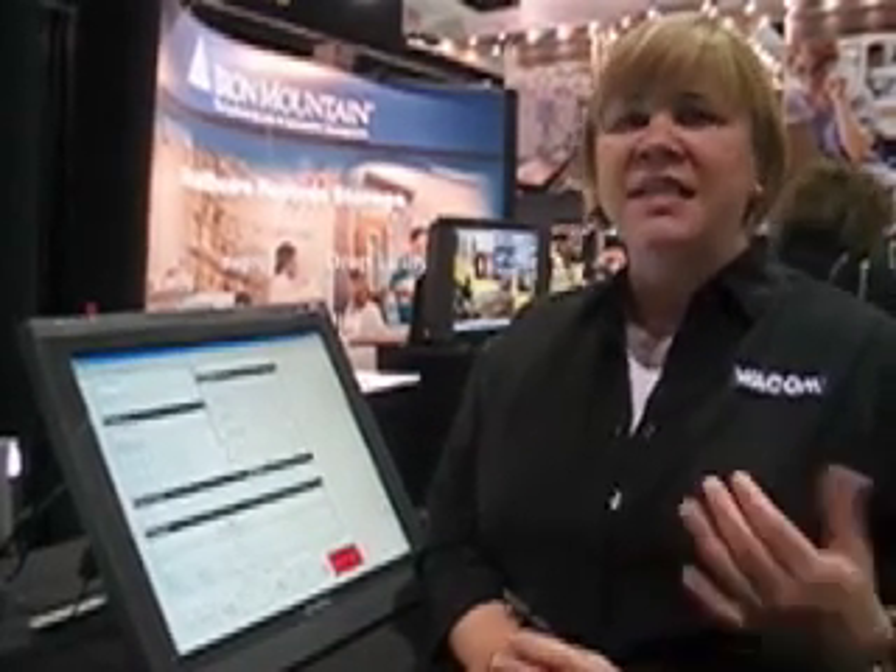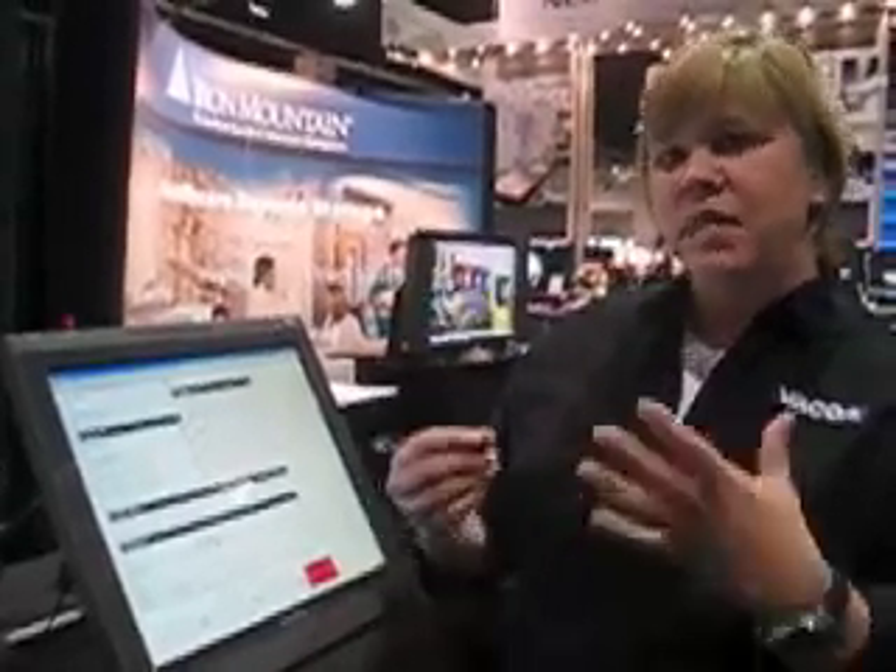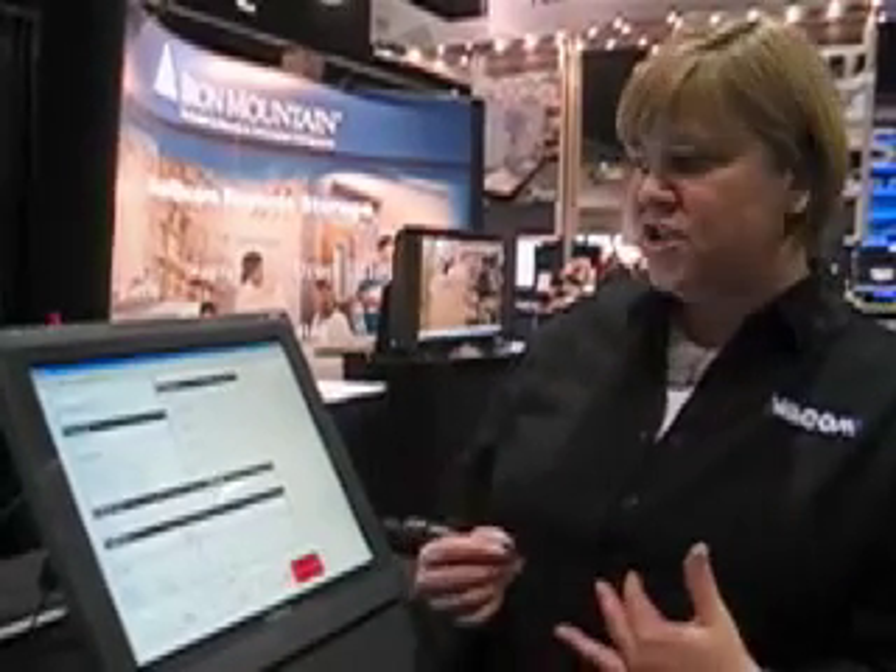Essentially what it is, it's an LCD monitor that has a pen tablet embedded inside of it. You can use it with your PACS system or with your RIS system, and it essentially gives you pen input capability into your existing workstation.